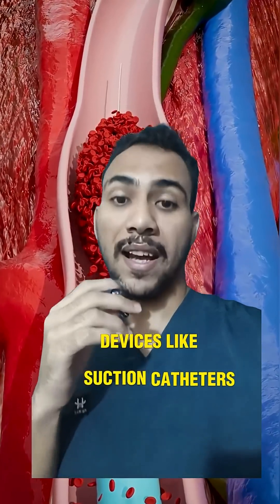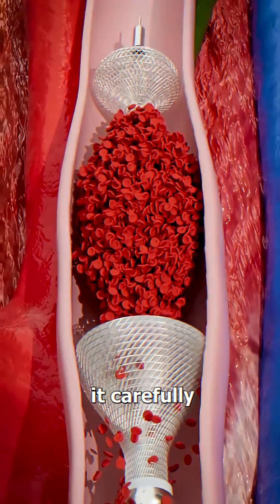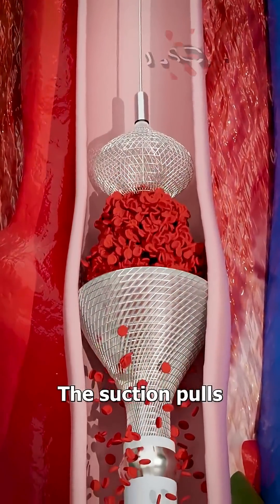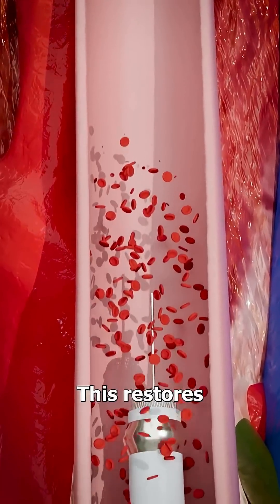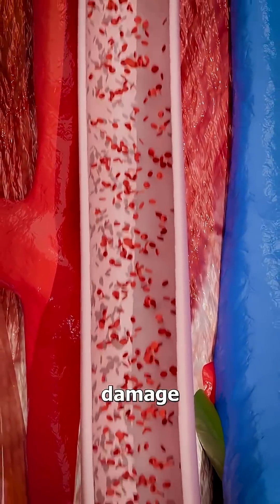Devices like suction catheters, stent retrievers, or aspiration catheters are used. It carefully guides over to the vacuum, and the suction pulls the clot inside, removing the blockage from the vein. This restores blood flow while leaving the inside of the vein with minimal damage.